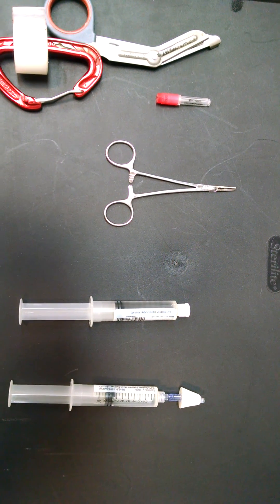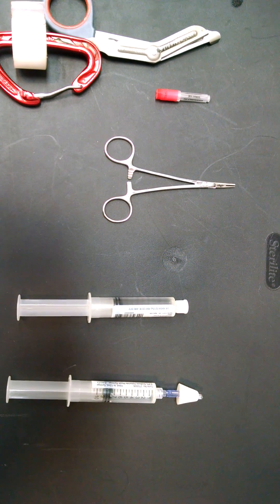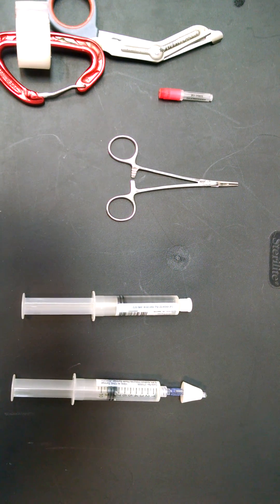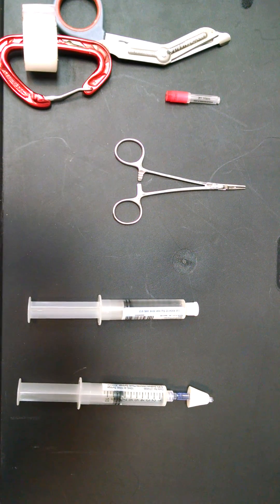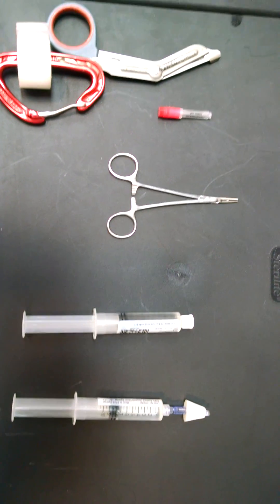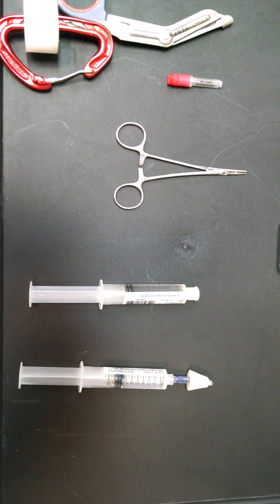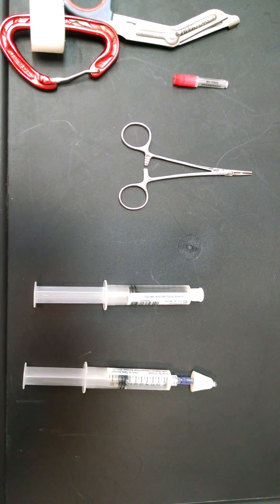I'm going to show you how to make an improvised mucosal atomizer device, or MAD, using only a 25-gauge needle or a larger gauge, such as a 27-gauge. It essentially atomizes a medication very similar to the MAD device.